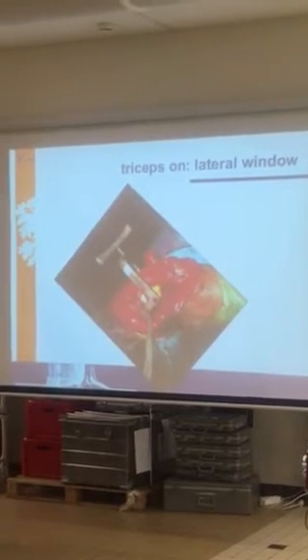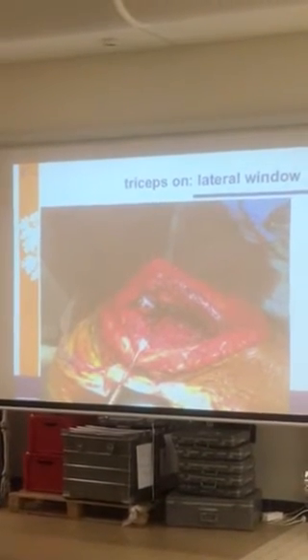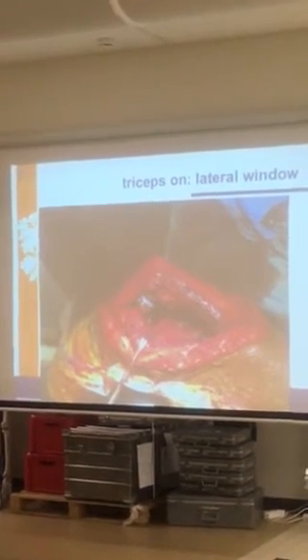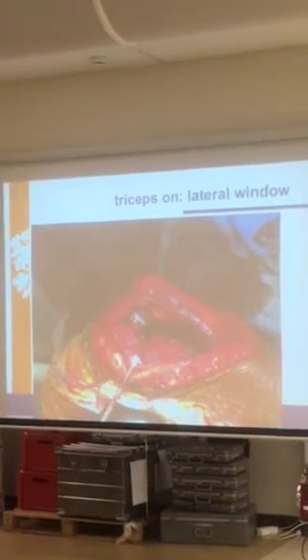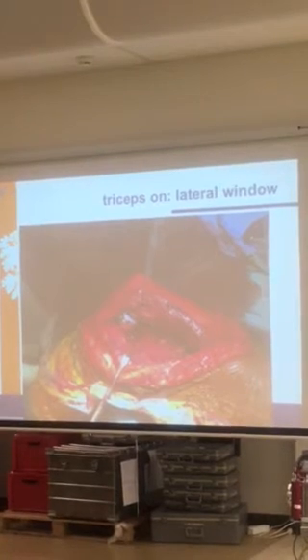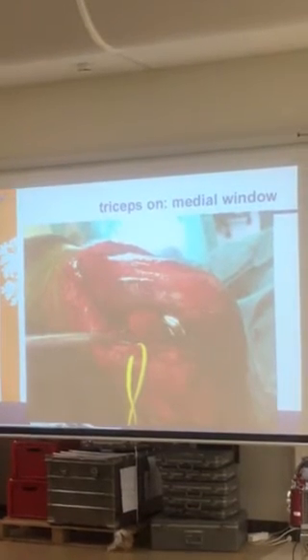This is the part of the procedure looking from lateral, and this is when the prosthesis is inside. You have a view. I forgot to put in the slide with the complete dislocation. You can really dislocate the humerus through both windows if you want, so you get a good view on the humerus side. For the ulnar preparation, it is a little bit of an indirect view, so you have to get used to it and learn from it. This is from the ulnar medial side. Still look at the vessel loop.